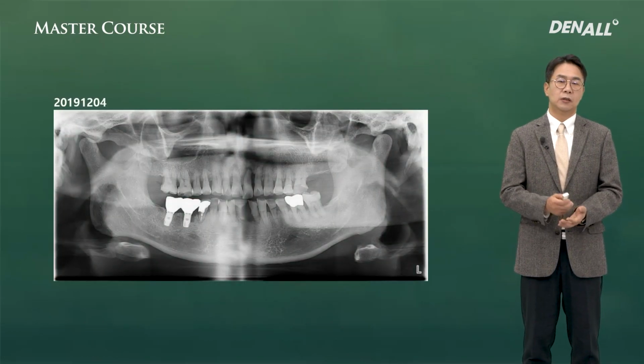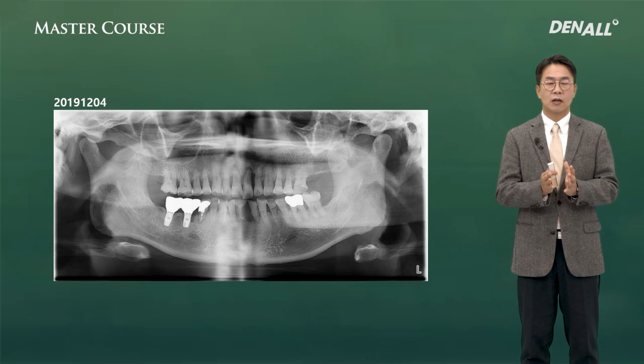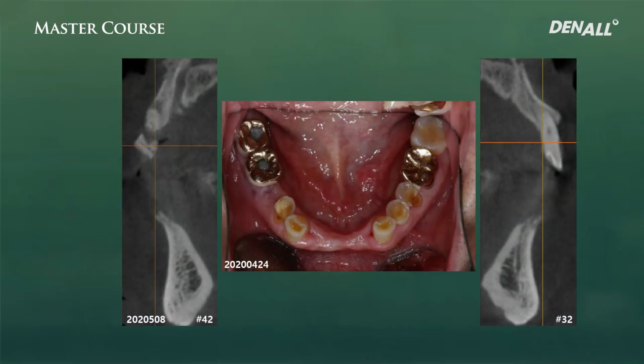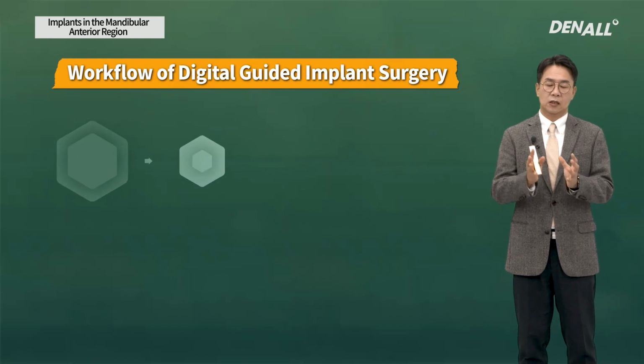If you look at this case in the mandibular anterior, this is similar to the previous case. So the teeth are extracted. Compared to the previous patient, the condition is better. However, positioning is very important here too.